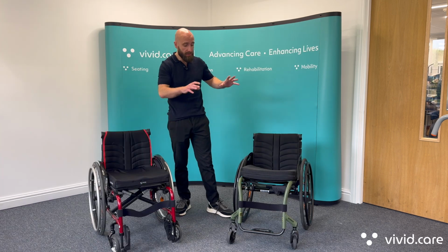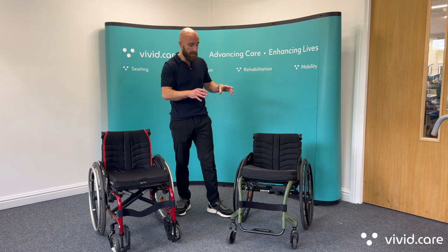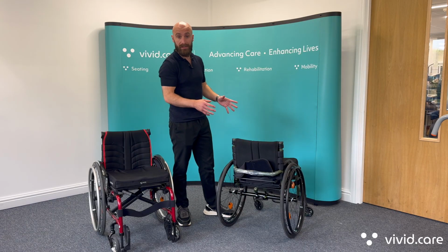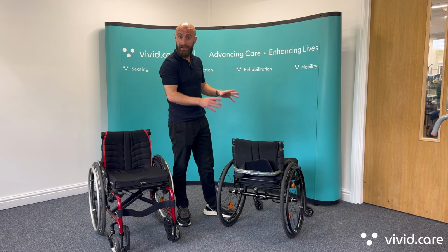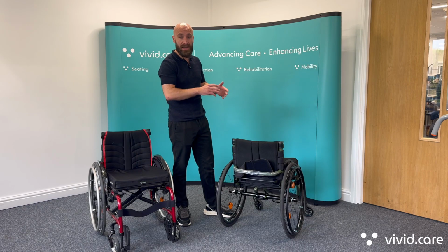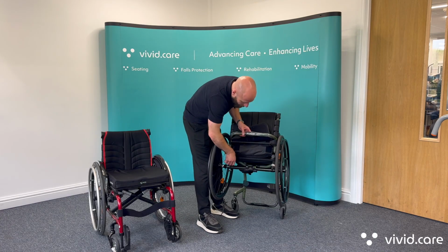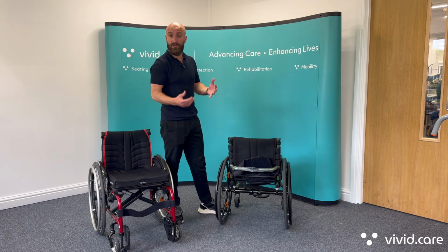So generally speaking, rigid is a very popular option when it comes to active user wheelchairs, mainly because you don't have any folding mechanism on the chair underneath. What that enables them to do is reduce the weight of these chairs. Because there's no extra mechanism underneath, they always do tend to be lighter, the rigid equivalent to the folding. Also, the lifespan of the product is very good, because there's no folding bracket on the inside and it's just solid metal all the way across. Often the chairs stay feeling new for much longer.